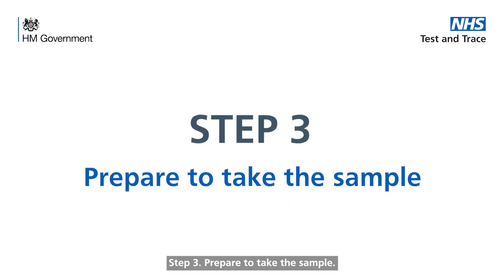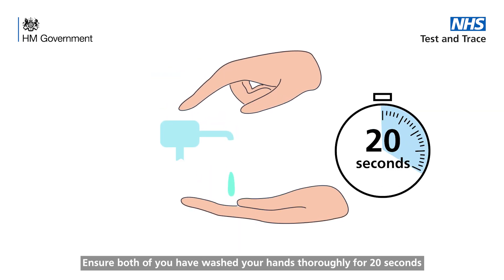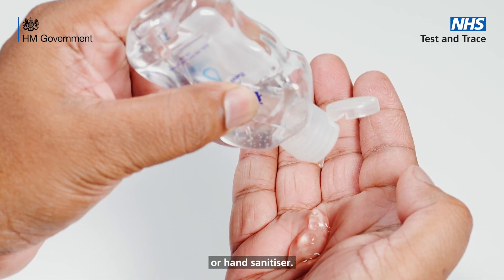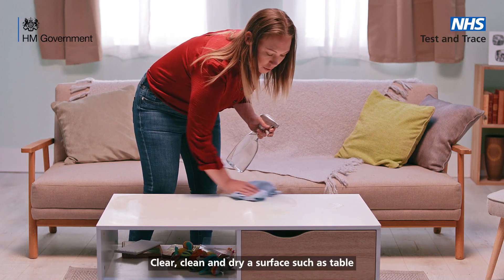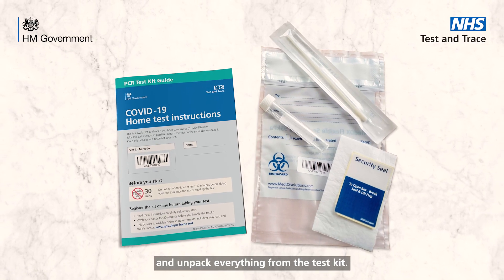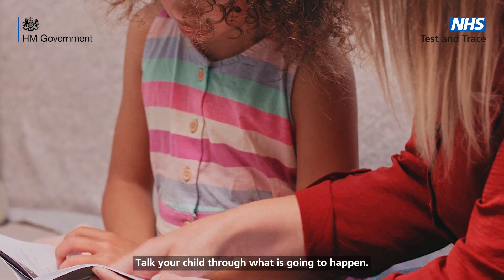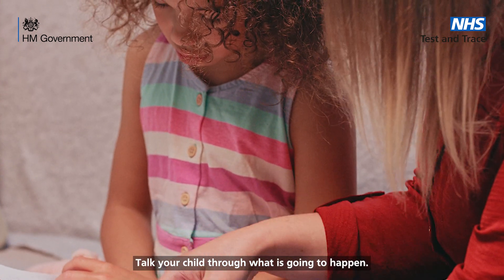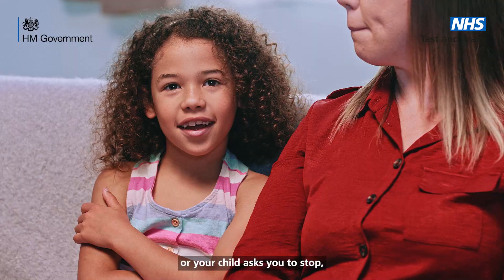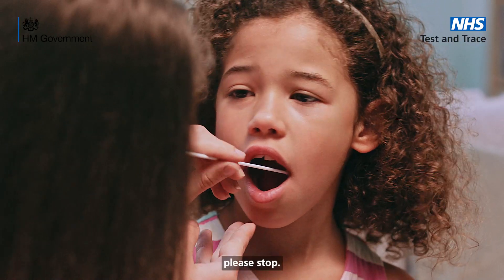Step 3. Prepare to take the sample. Ensure both of you have washed your hands thoroughly for 20 seconds using soap and warm water or hand sanitiser. Clear, clean and dry a surface such as a table and unpack everything from the test kit. Talk your child through what is going to happen. If you are worried about testing your child or your child asks you to stop, please stop.